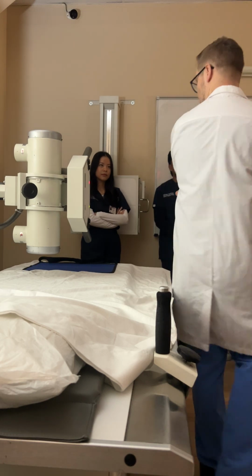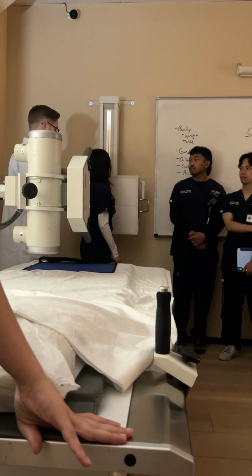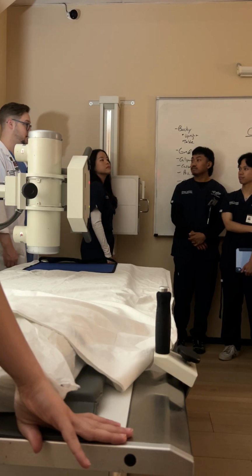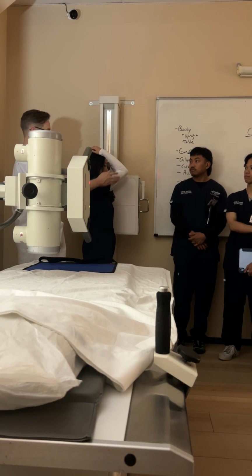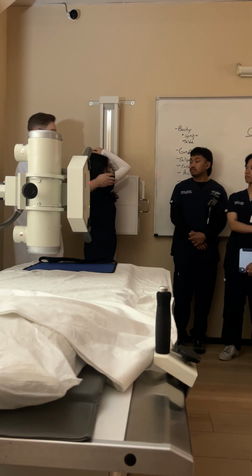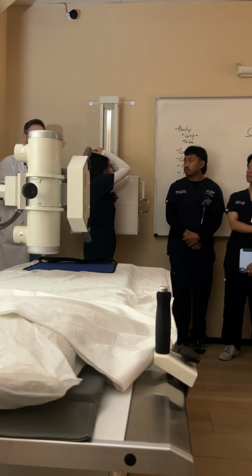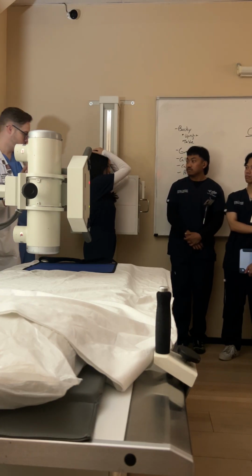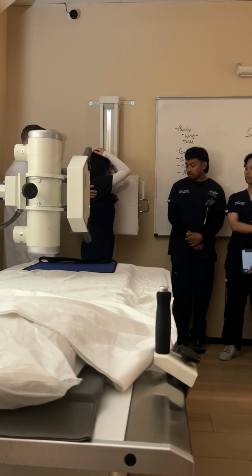Okay, let's do a lateral real quick. What's your centering for a lateral? Mid-coronal, yes, T7, great. Let me have you raise both of your arms up, bring those elbows together. We're going to keep the elbows up. One more important distinction here: she looks like she's pretty well positioned, right? Wrong! Separate your feet a little bit for me, and move that one over. Now stand up straight and step into my bucky with that left foot.